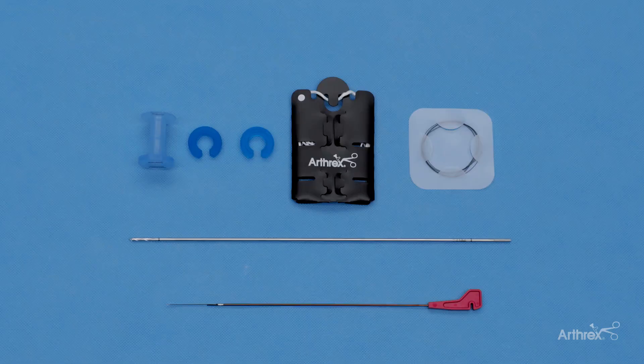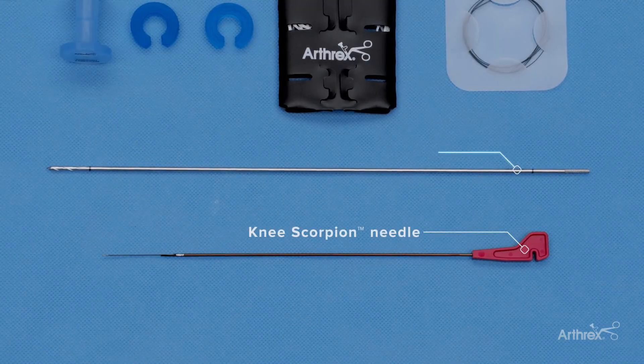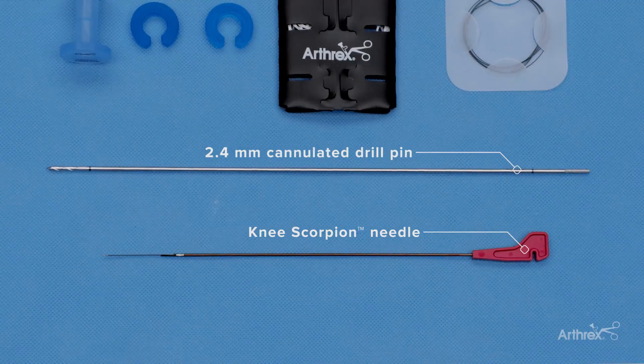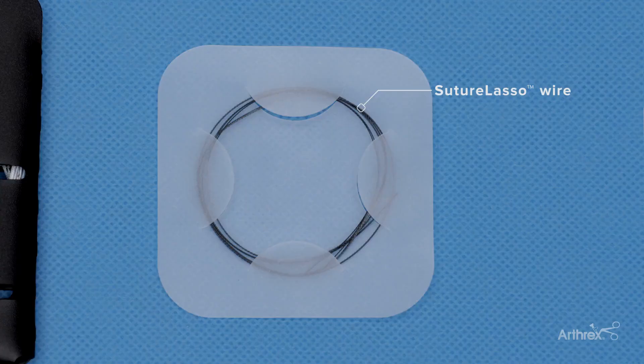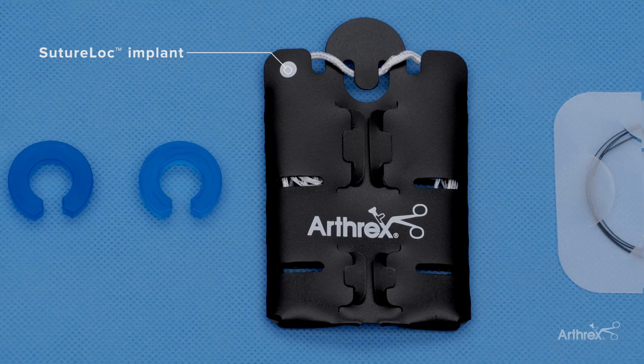The SutureLock comes in a kit that has everything you need to accomplish a meniscal root repair. There is the meniscal scorpion needle, a 2.4 millimeter cannulated drill, the nitinol passing wire, an 8 millimeter by 3 centimeter passport cannula with two spacers, and the SutureLock Implant that comes pre-packaged on a card. This is the SutureLock Implant taken out of the card, and it's important to see how the SutureLock is going to work inside the knee in order to get a secure meniscal root repair.